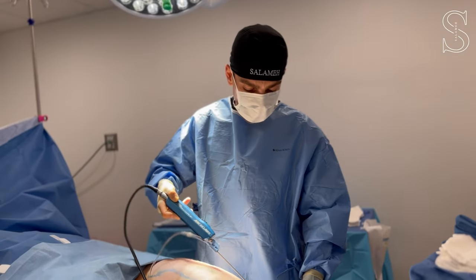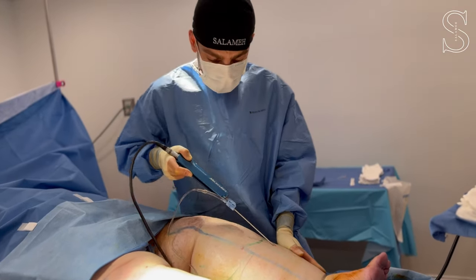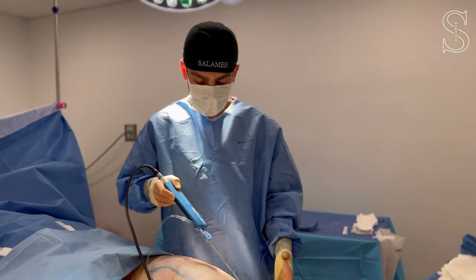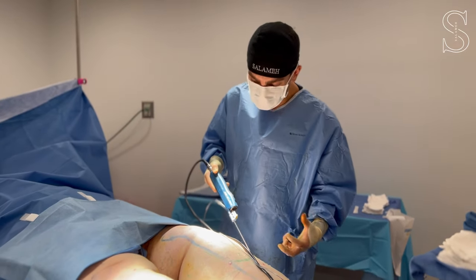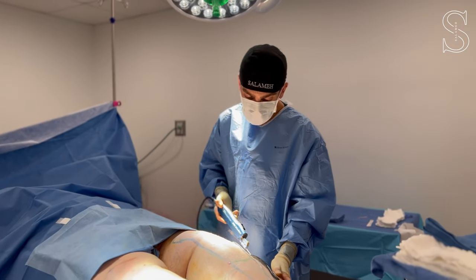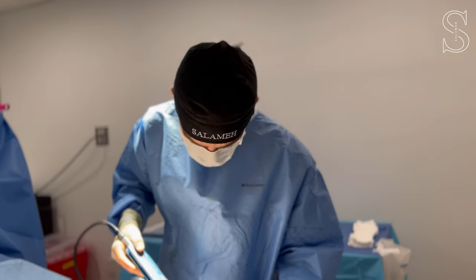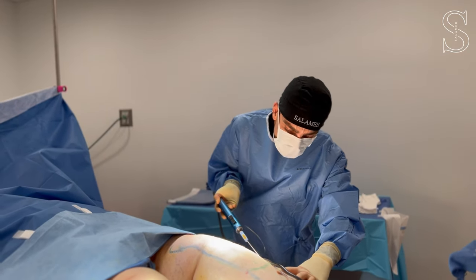As you can see here, our patient is more than 35 BMI, but again, it's not in her hands. It's genetics, and the treatment here is liposuction. So we're going 360 degree from the ankle all the way up until we hit the 5 liter mark. And we're gonna do that in stages safely until we get her to a point where her mobility is better, she feels better, the heaviness on the knees is better, her quality of life will improve, the pain's gonna improve, and really this is a life-changing procedure. Not every patient is the same, and it's not a cookie-cutter approach for everyone, so we take every person as an individual, and we come up with a plan that fits that patient's needs.